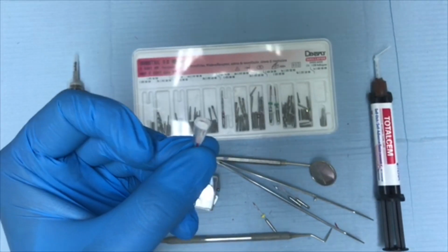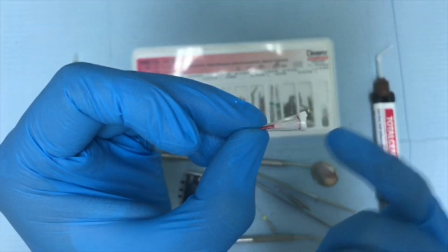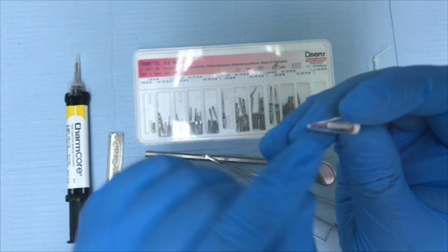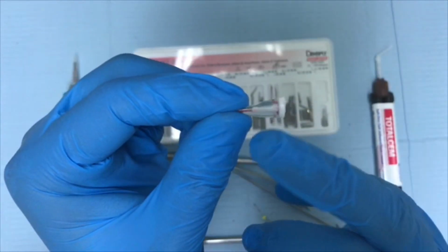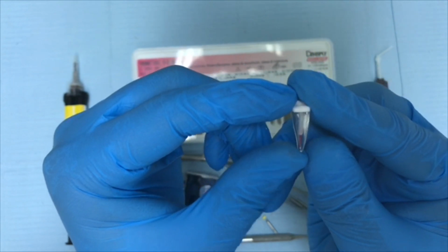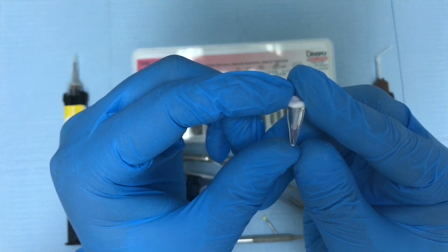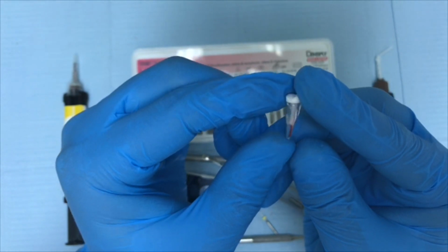Okay, now I'm done with the preparation, and as you can see here, the preparation reaches 2/3 the canal length, and also the diameter is 1/3 the diameter of the root. Also, the preparation is confined within the path of the root canal without any ledges on the mesial, distal, or even buccal and lingual sides.